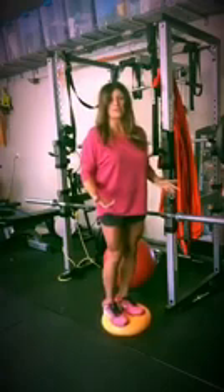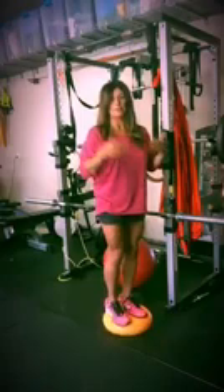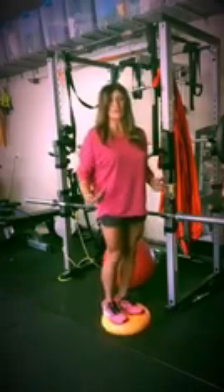But this disc is also very good for proprioception. When you're wobbling on it, it's helping your spine and also your postural muscles, but also your legs.